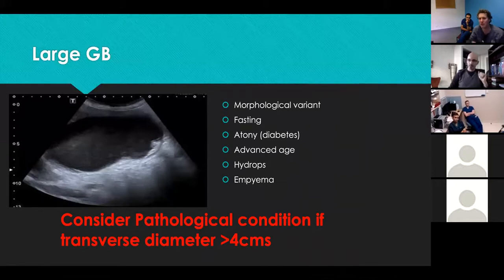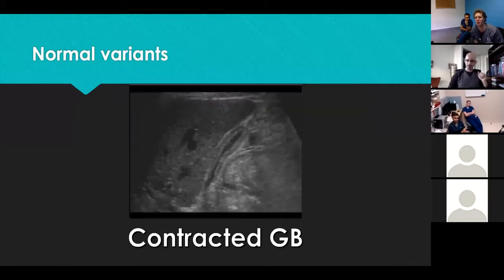Sorry, Payam, that's just like it is in the heart as well. So we talk about pseudohypertrophy in the heart with an underfilled ventricle, that the walls look a little bit thicker. So it's exactly like that. Oh, cool. Yeah, exactly the same thing.